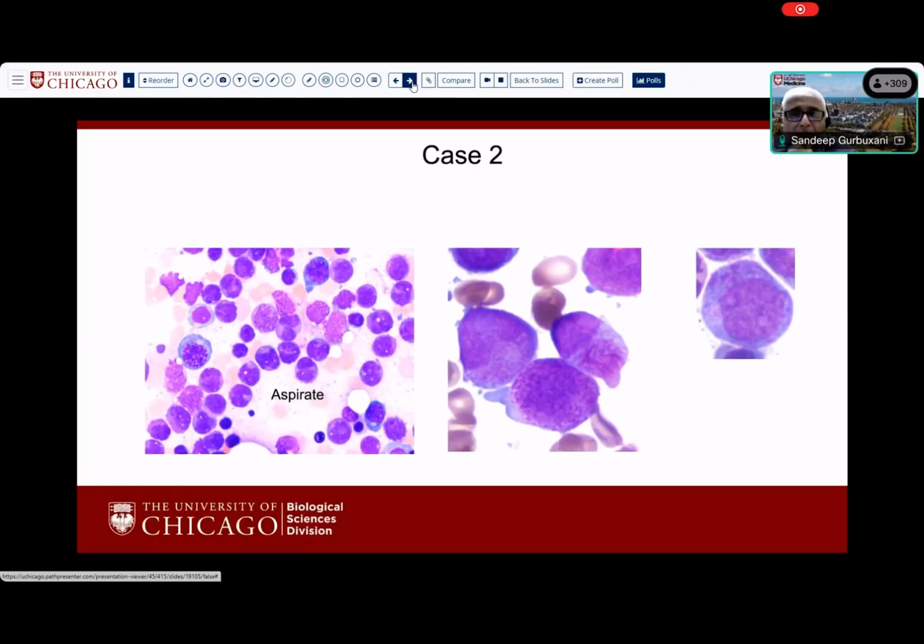So here I don't have a whole slide image, but on the right side I have the normal counterpart of these cells, and then here I have some abnormal findings. So a low power magnification. Does anybody want to give me some idea of what they think this might be? First of all, can we recognize this normal cell? Promyelocyte. It's a promyelocyte. Very good.